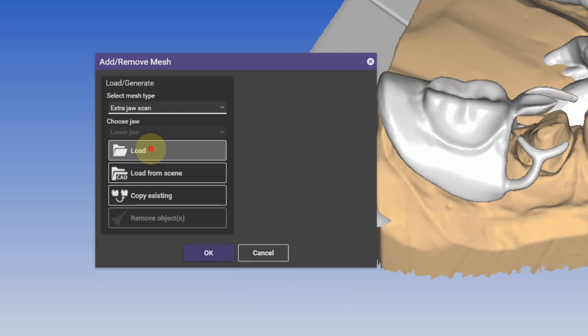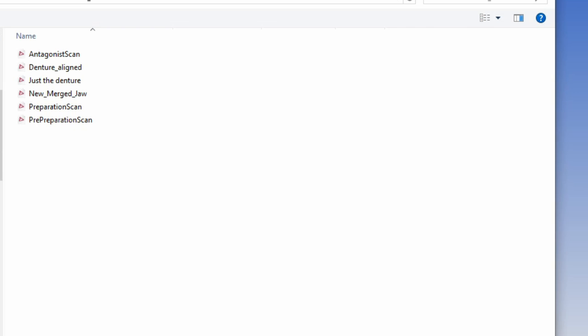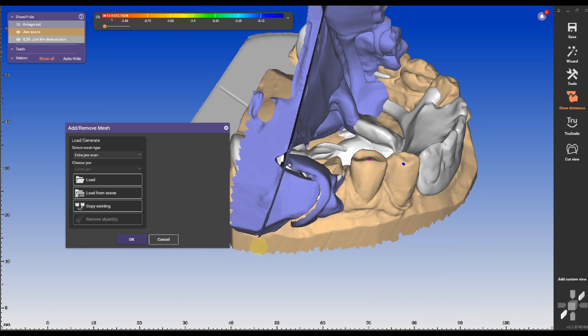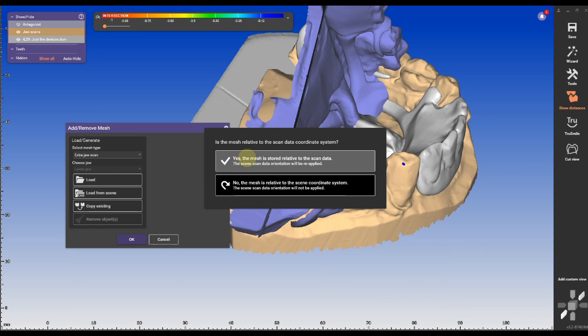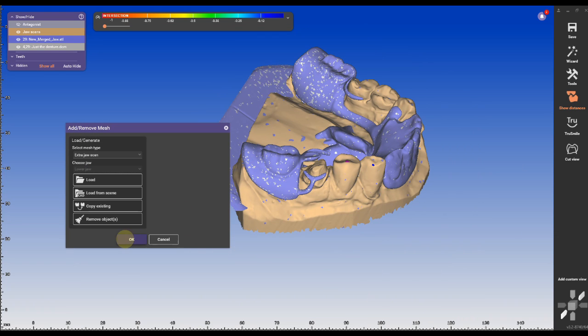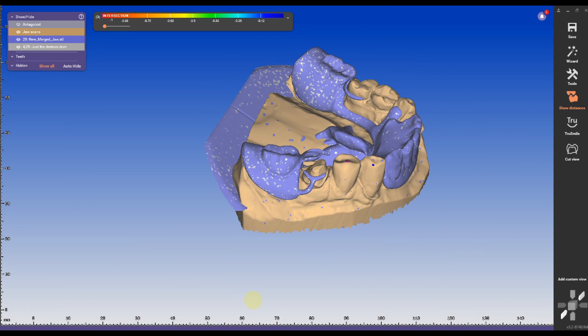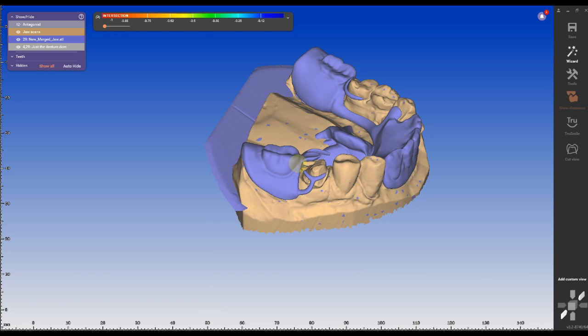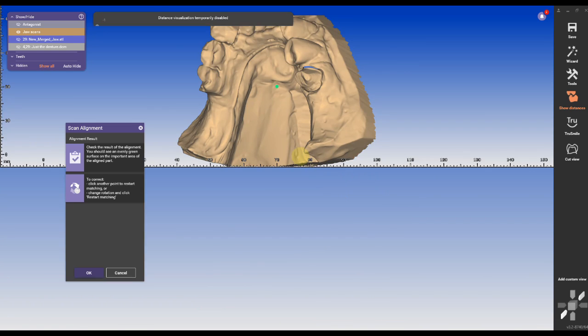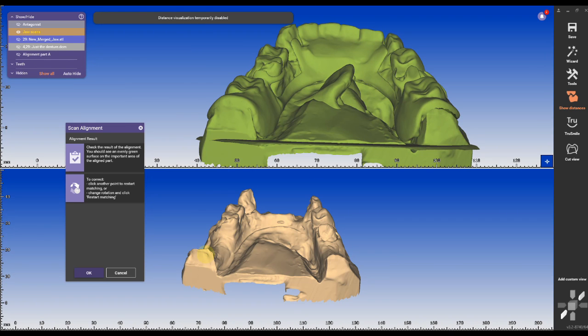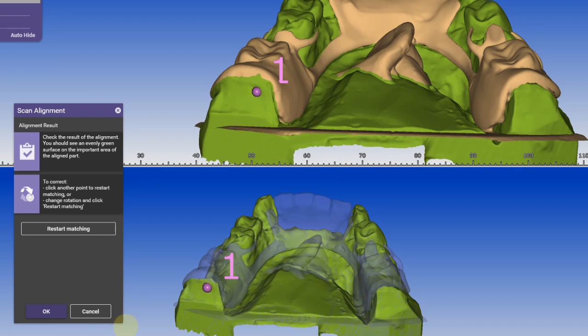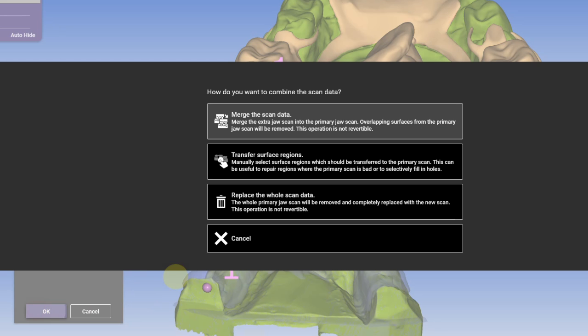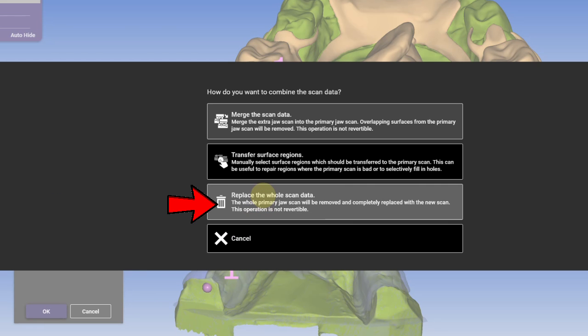To use this new file in my design, I have to import it as an extra jaw scan. You can use this method for other purposes as well. This was one of my questions in the comment sections - how to swap out jaw scans if you already have designed a crown. The key is to align the preparation scans and swap out and replace entire scan data.